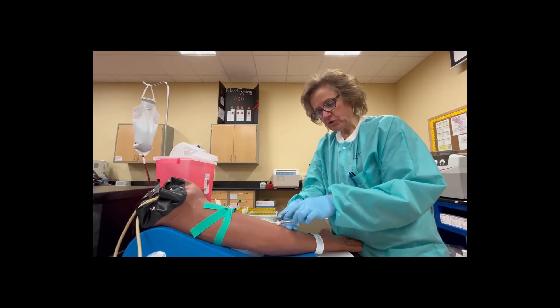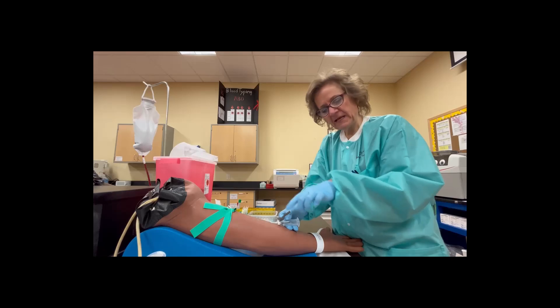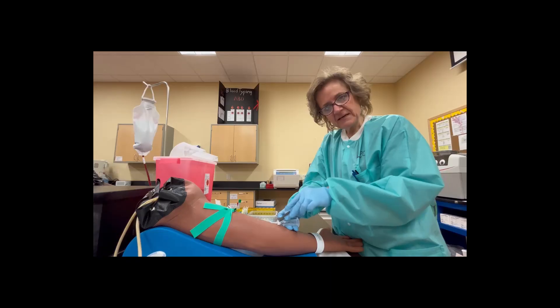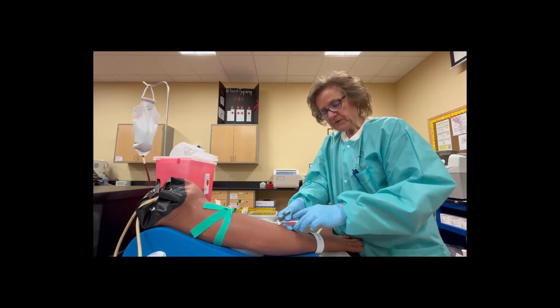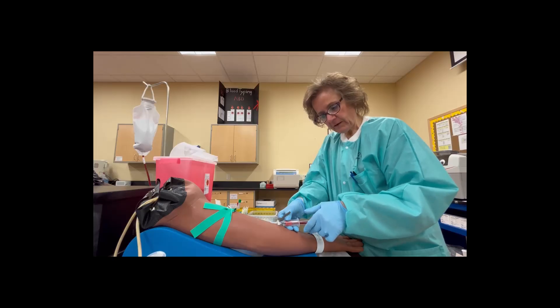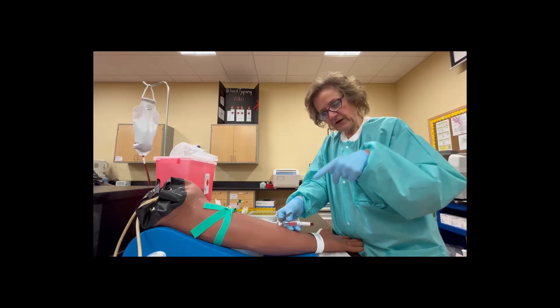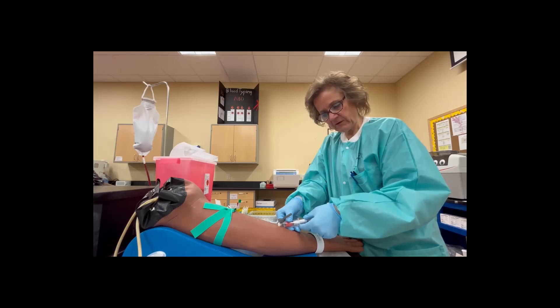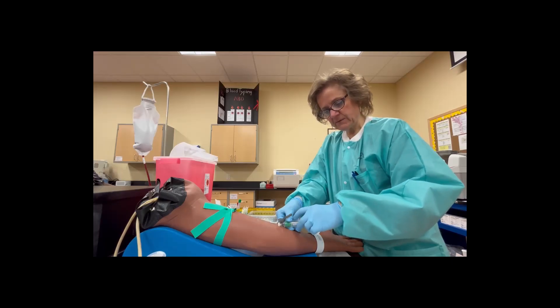The second anchoring: you're going to anchor your thumb pushing it down against the skin. This way, if your patient moves, your arm moves with them. By pushing your thumb against the adapter, against your fingers, against the arm, you're anchoring the adapter in place. When we go to add the tubes, we take the tube, put it on, and use the flange to produce counter pressure — push it on and let it fill. To remove, use the pointer finger against the flange and these two fingers to pull it out. Mix it before going in with the next tube — put the tube in using the flanges to push it in.